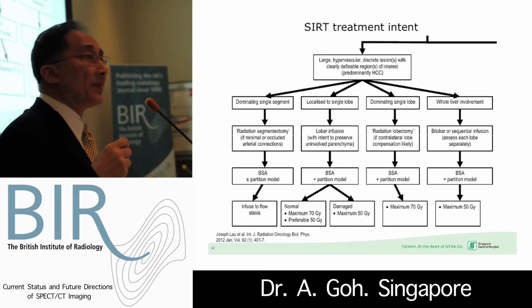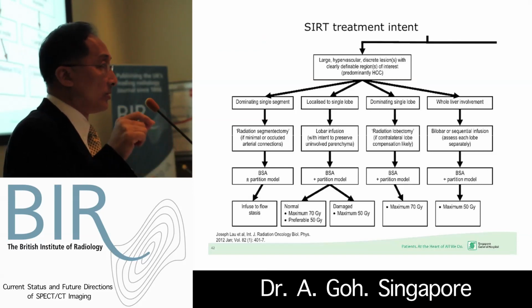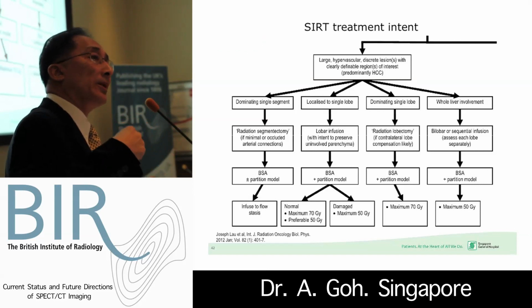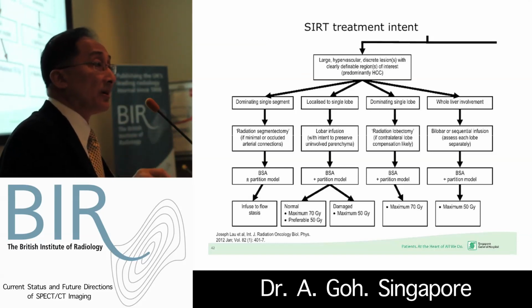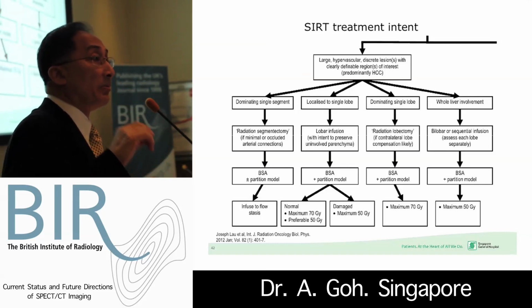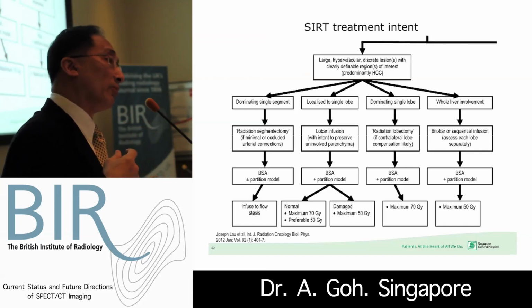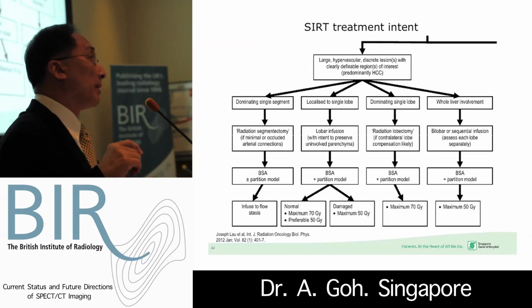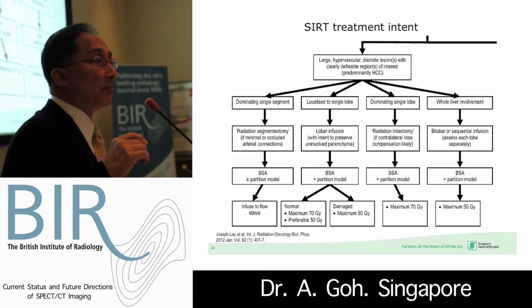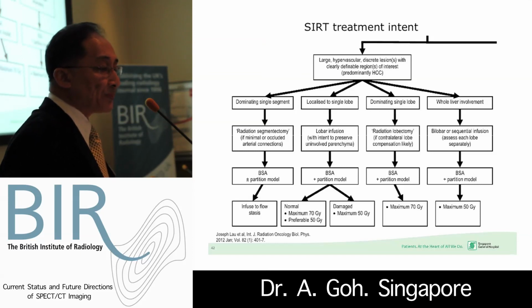At the same time, because we are able to predict in advance where our dose is going to be deposited, we also can predict in advance which areas of the tumor or which tumors would be undertreated or non-treated, and in which case we may need to address these areas separately, such as with radiofrequency ablation or very careful surveillance. So being able to predict in advance which areas we need to be on the lookout for is an advantage of using this methodology.